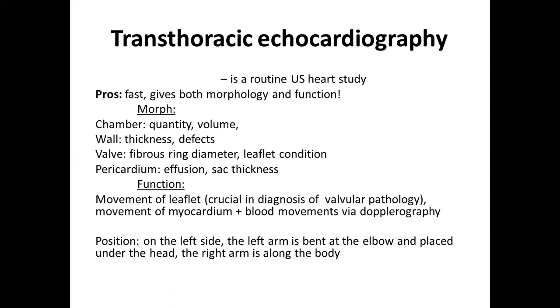On the opposite, if your patient has hypertrophy, you may see thickening of the heart. We may see defects, and that is very useful if we talk about septal defect or a defect of the myocardial wall after trauma or after rupture due to some reasons.